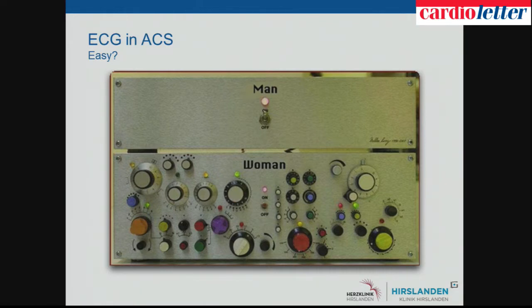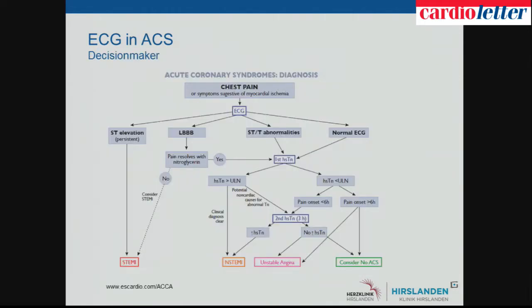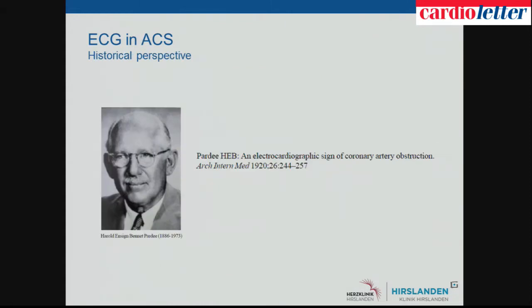There are other things that might be a bit more complicated. Is it important? Yes, it is. You will see that the ECG is in almost all algorithms of acute coronary syndrome, one of the big decision makers on top of every pathway, just after the clinical setting and examination. Is it new? Not really.